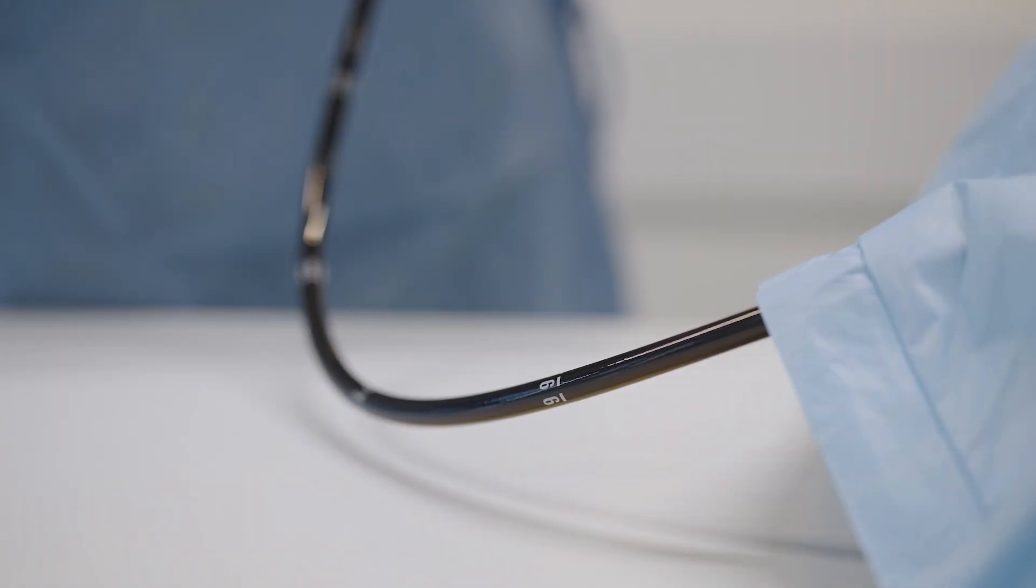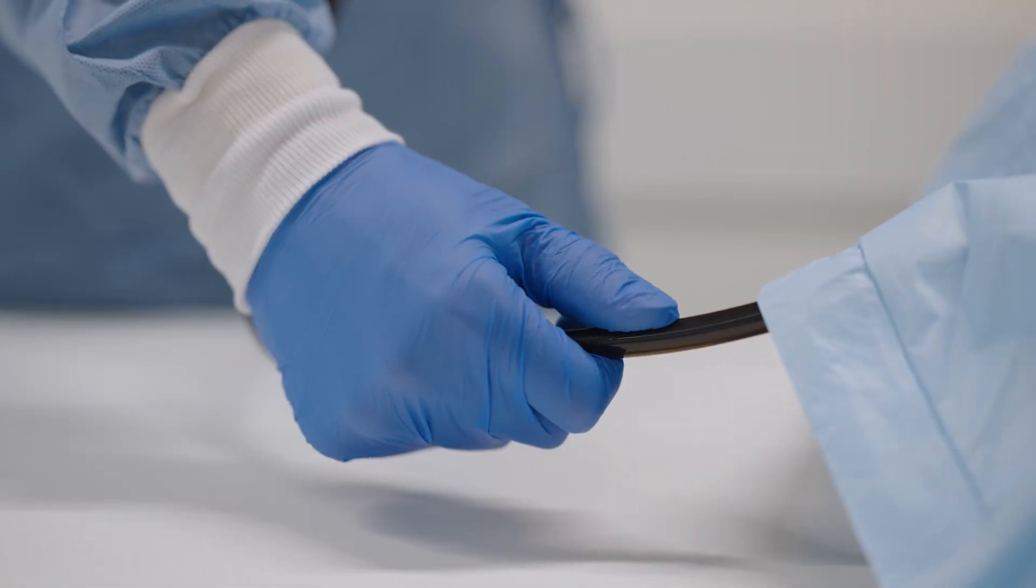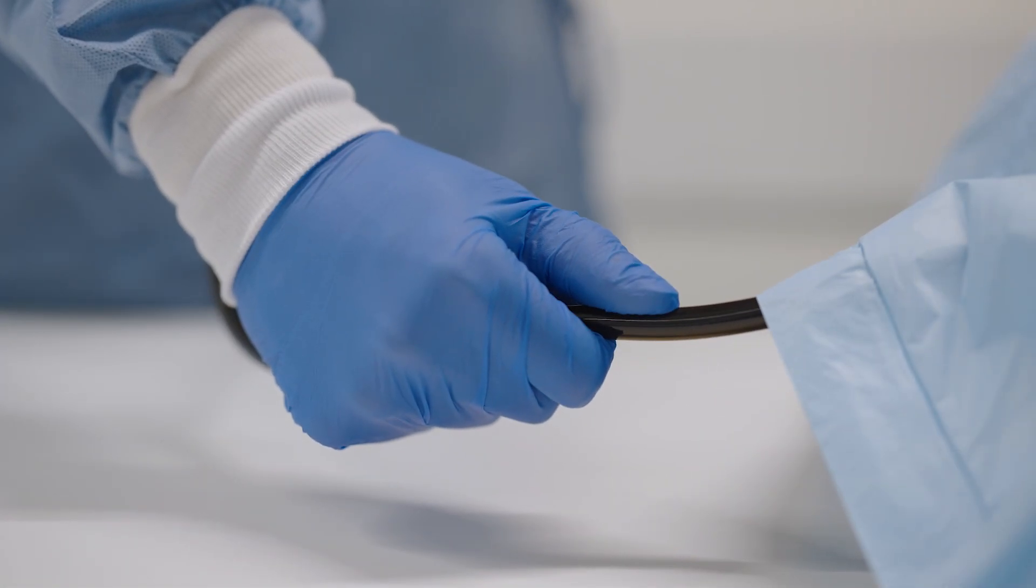To prevent the endoscope from slipping during clip application, hold the endoscope in front of the patient's mouth before application.